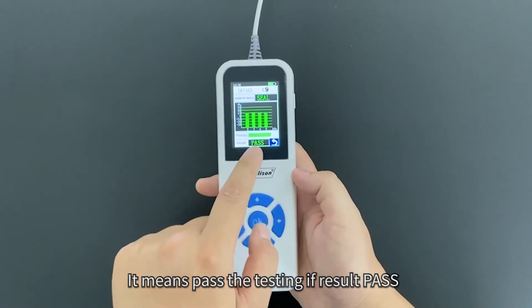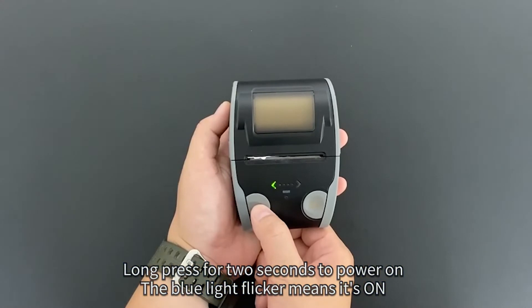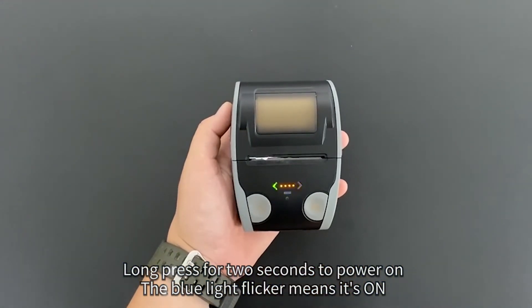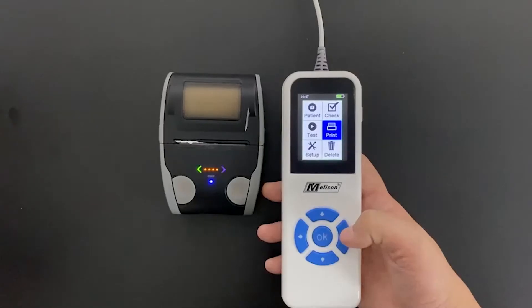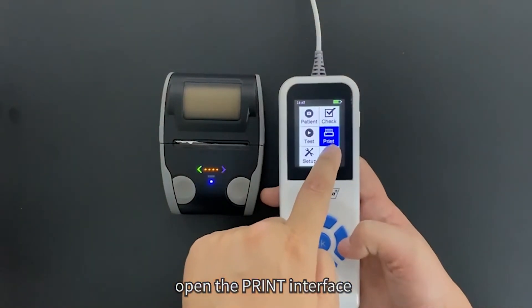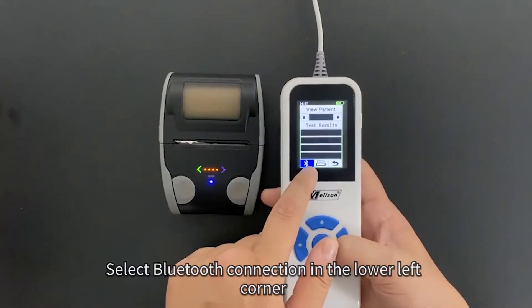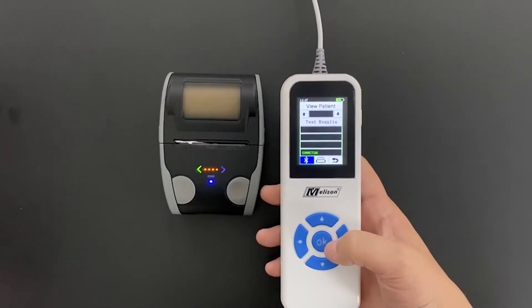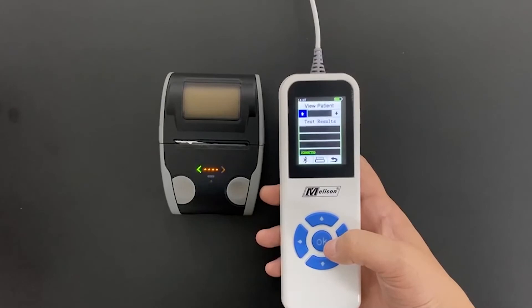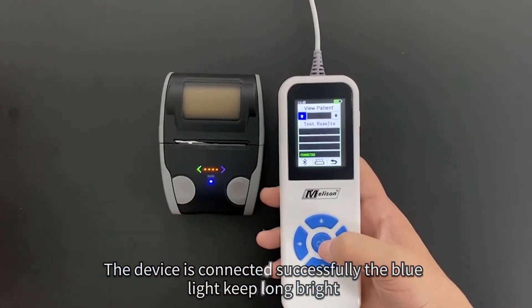Long press for 2 seconds to power on the thermal printer. The blue light flickering means it is on. Open the print interface and select Bluetooth connection in the lower left corner. Once the device is connected successfully, the blue light stays long bright.